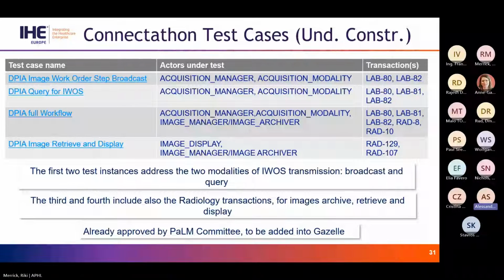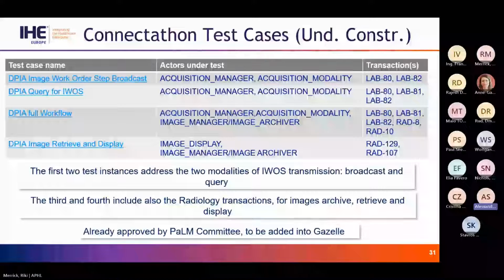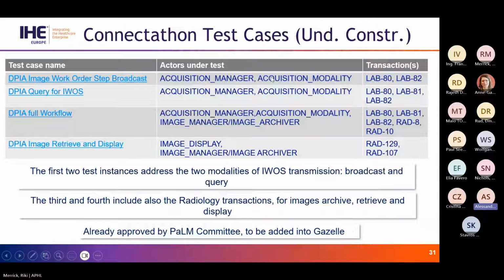Some of them are mainly roles of the laboratory part of the profile, we can say. So the acquisition of the slide, the interaction between the acquisition manager and the acquisition modality actors. And then we have a second part, which is mainly a radiology part that involves image manager, image archiver, image display. For this part, we have adopted in the profile some of the radiology transactions, for example, RAD8, RAD10, and so on. So these are the four test cases.